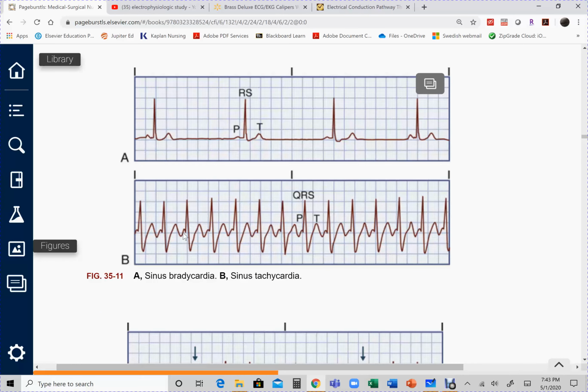And if you do the same for this rhythm, you can see that here, this is the start of my P wave to this one. So that's 1 right here, 1, 2, 3. So it's measuring 3 small blocks. So PR interval is normal. My T wave is upright. Although the ST is not very clear, simply because the heartbeat is too close. There's too many PQRSTs packed into this 6-second strip. So this is sinus. All other measurements are normal except the rate.